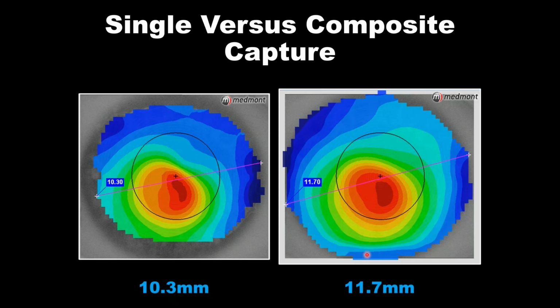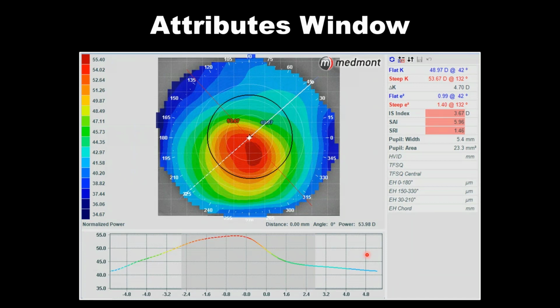So related to large diameter rigid lenses, related to scleral lenses, this is the tool that you want to use with every one of your captures.